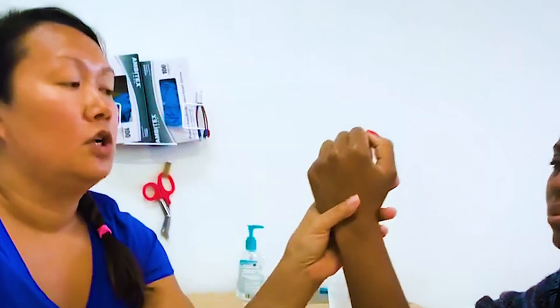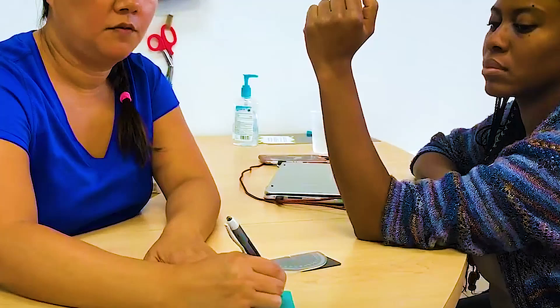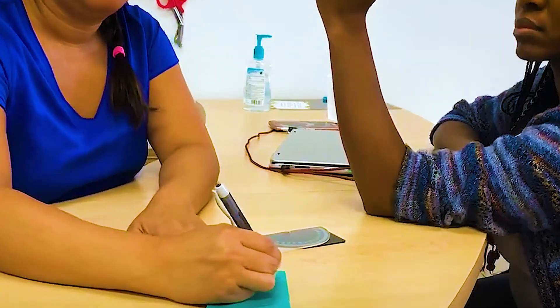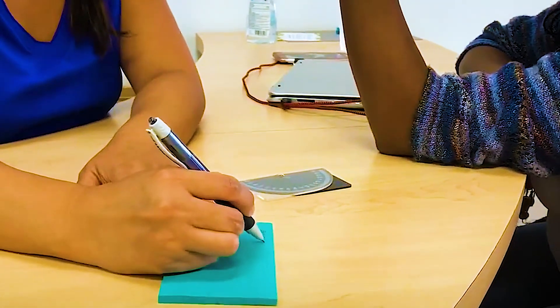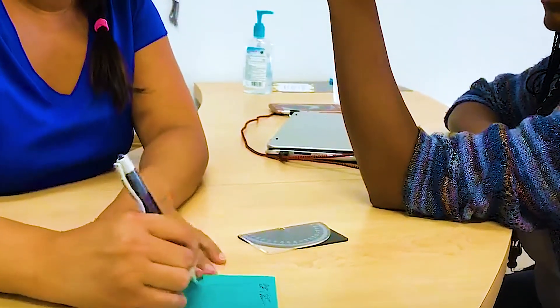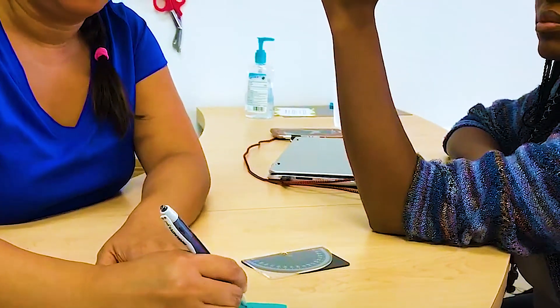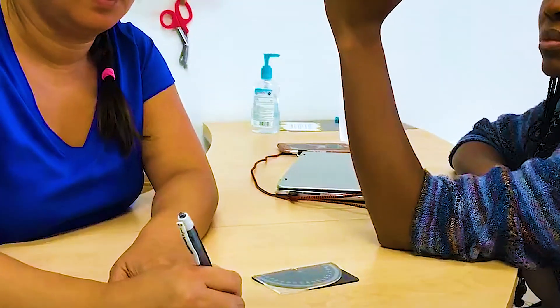Anytime you're measuring with the fingers on this, one of the reasons why I love it so much is because it's really easy to read. All you have to do is place it. So it's always finger extension slash finger flexion. I usually do it on a grid. This is MP, PIP, and DIP.